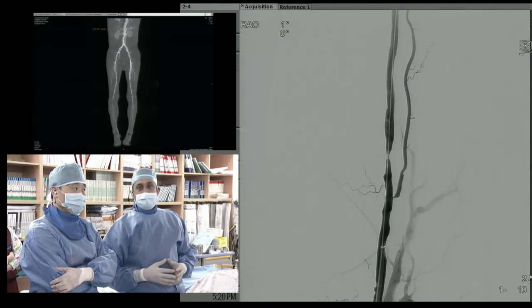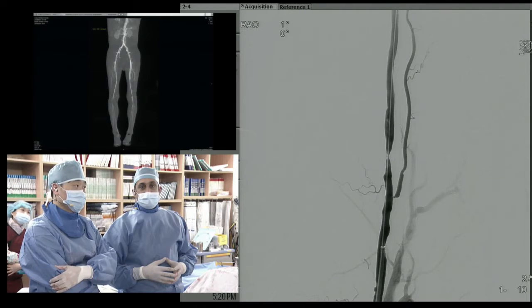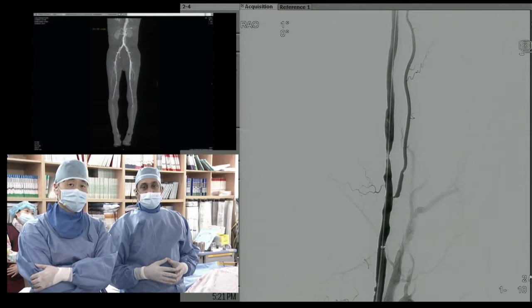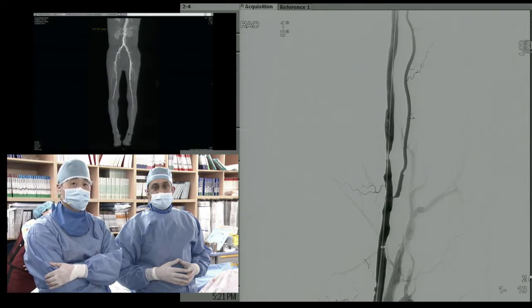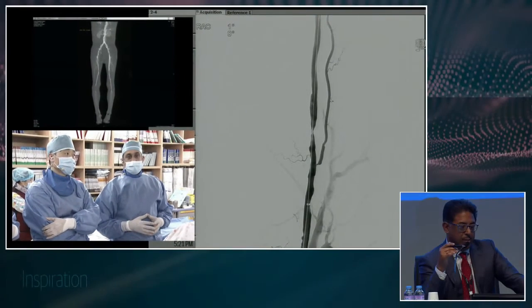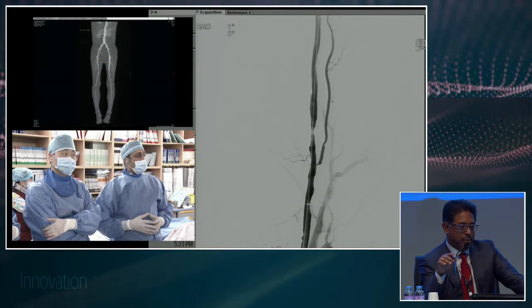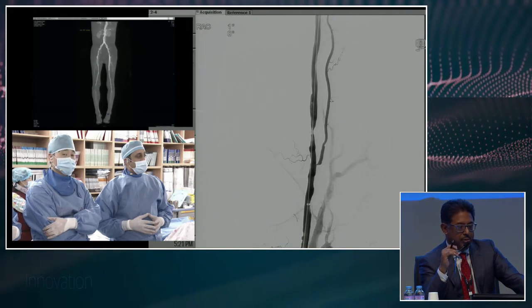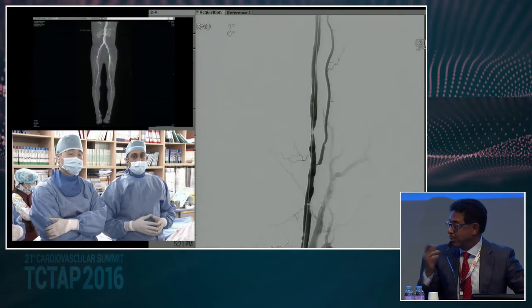I think what I would do with this would be predicated on what the angiogram showed distally. This is a patient with CLI, obviously, and I would have probably given the most durable result. This is an inflow lesion that may impact on runoff and what you do with the runoff. So, Ravi, I wouldn't be able to answer your question because I haven't seen the runoff and what you plan to do with the runoff. But to Lawrence's point, maybe less is more, balloon angioplasty here, but I suspect even with this, Lawrence, you'd probably come back, don't you think? Even though it's a small, short lesion.